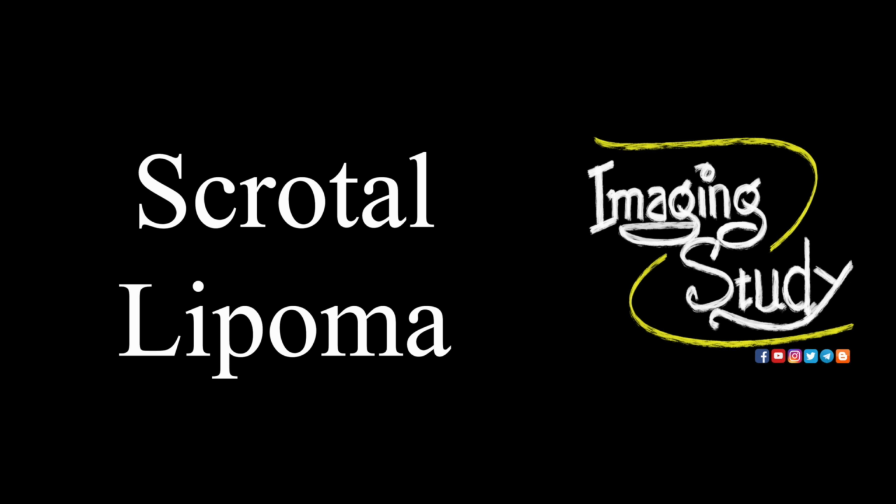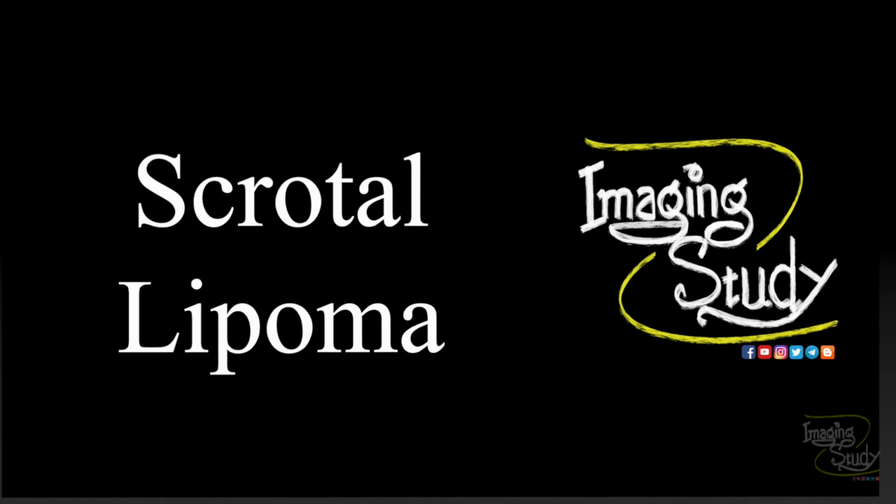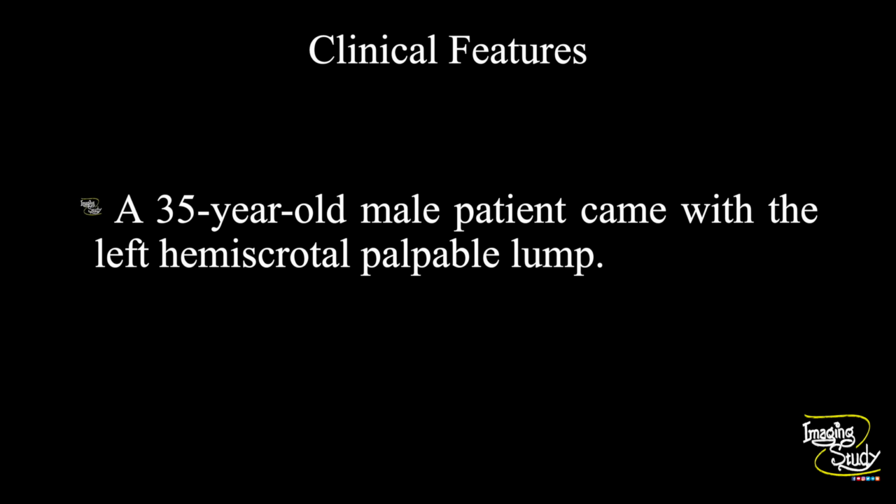Today we are going to see a case of scrotal lipoma. A 35-year-old male patient came with a left hemiscrotal palpable lump. It was painless, but the patient was worried about that. So he went to the doctor and the doctor referred him to us for further evaluation on ultrasound. Let's see what we have got on ultrasound.